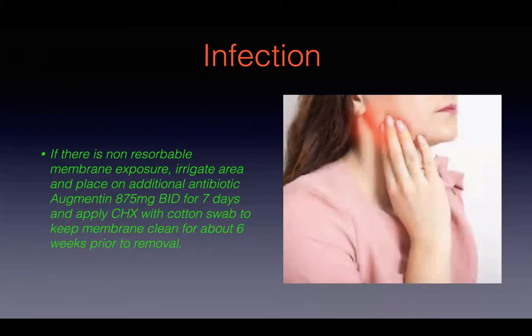So the plan here was to remove tooth number 20 and put in the 3 implants, and then also place an implant at site 30. But we had the same issue like I did 5 years ago with her. Not enough bone. Very narrow ridges. So I dropped a digital implant here, the narrowest that I can place for each of these sites. And the bone, I mean, there's just not enough bone. She knew this already. So we set her up for a GBR and staging this.